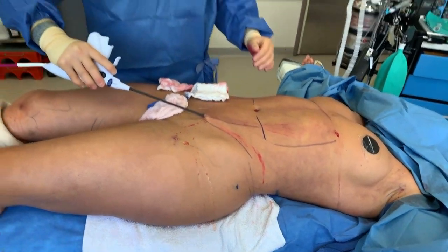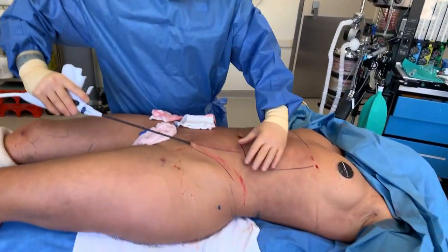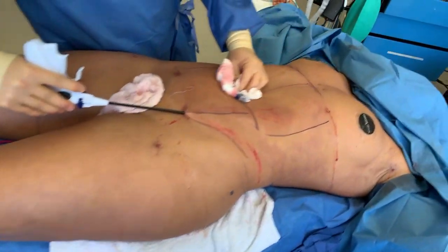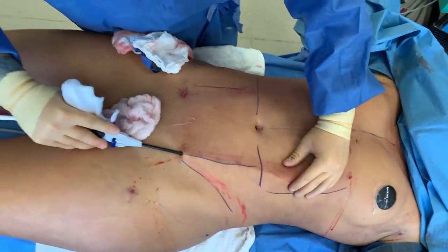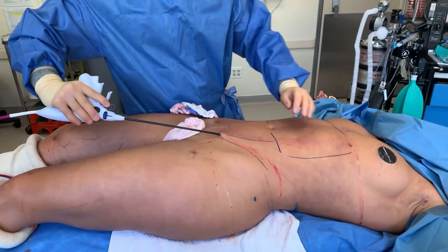So that's it, you guys. We're going to continue to contour — follow on Snap. We're going to do this in numerous areas and do her arms. We did her legs. Show them again the nice tightening, the nice effects. She's a little bloated now from the tumescent fluid, but overall she's going to look super slim and athletic.